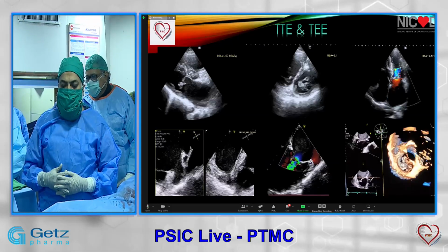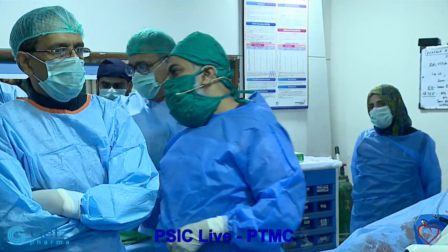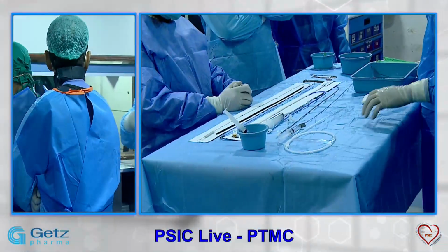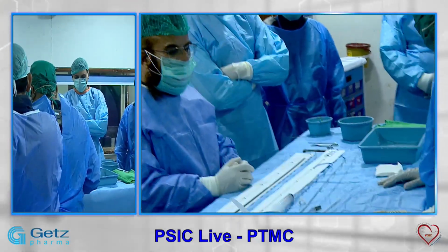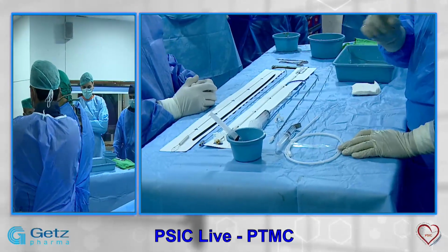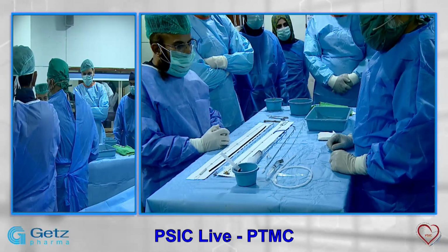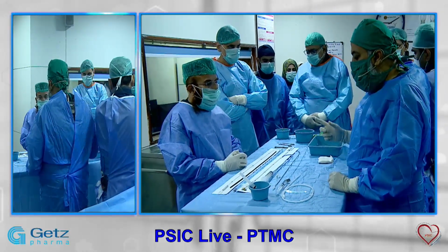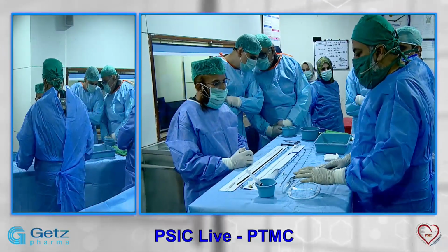Okay, what we are going to do is, we will be discussing the steps, and we will have a slideshow before we start. Okay, let's start with the equipment.